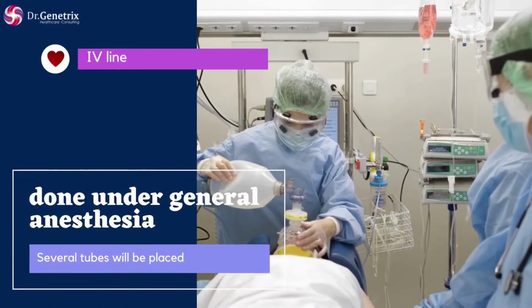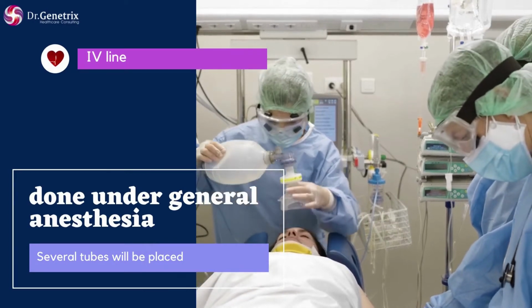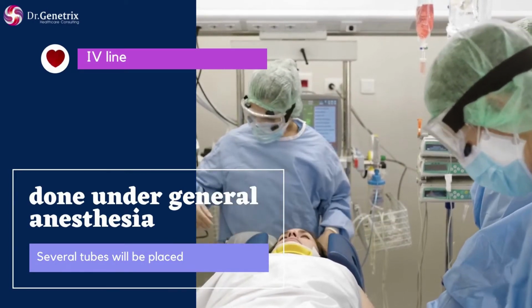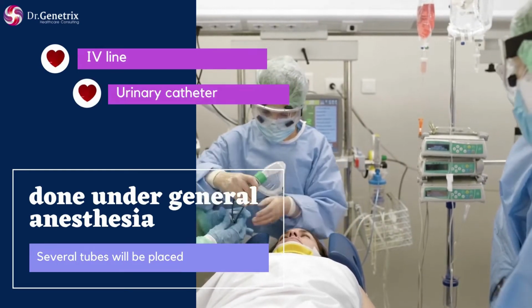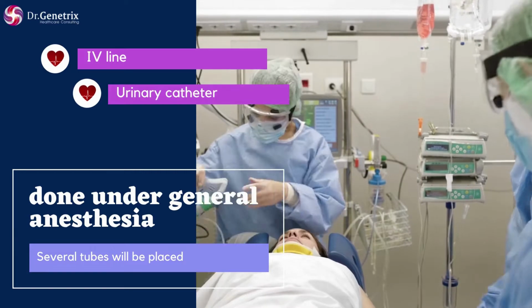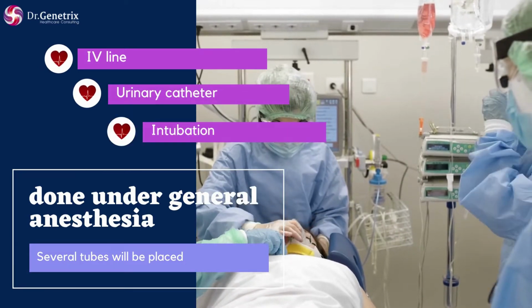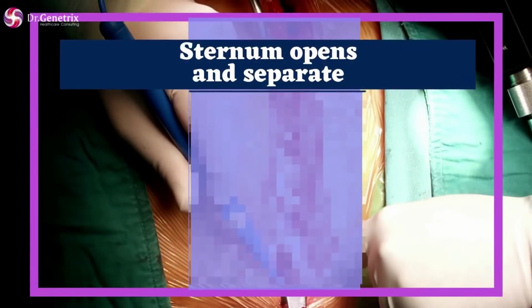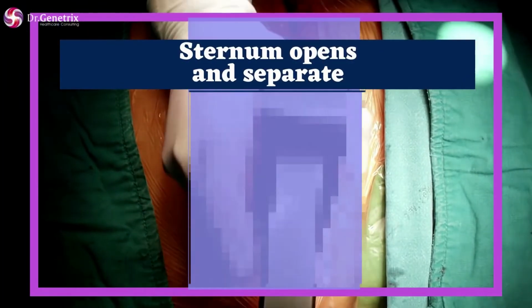Before you get anesthesia for the operation, an IV line will be placed in your arm for fluids and medications, and a urinary catheter will be inserted into your bladder. A tube will be inserted through your mouth into the windpipe, in order to help you breathe while you sleep during surgery. Once you fall asleep with the anesthesia, your surgeon will make an incision in your chest. The surgeon will then separate the sternum.